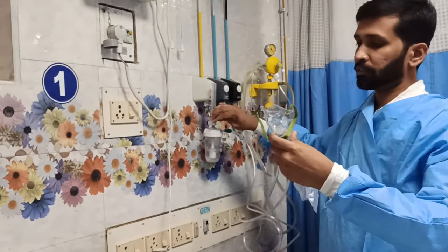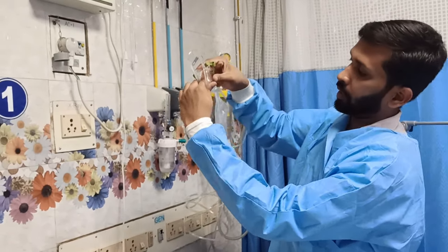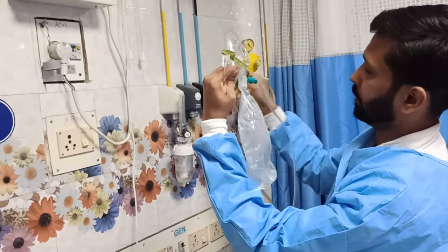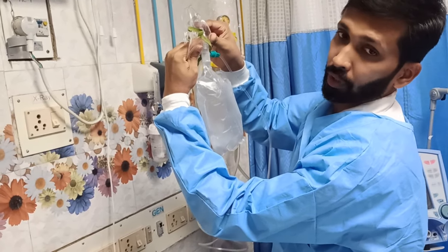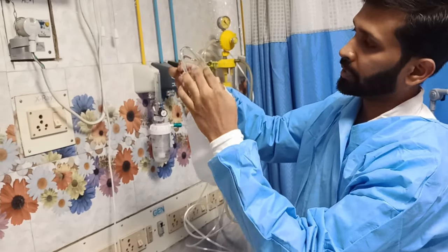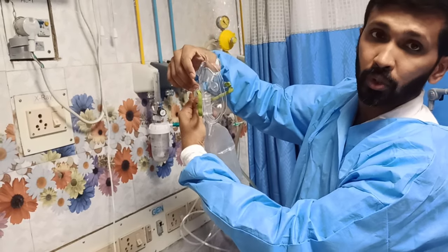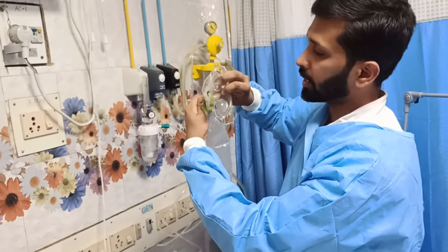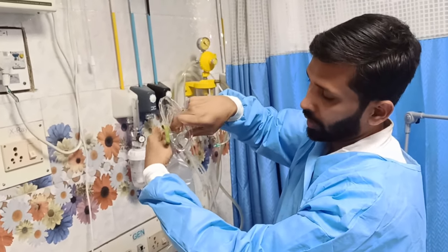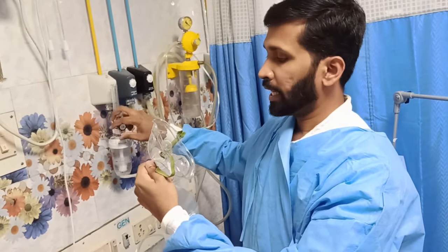Open the oxygen fully, and first close this valve, then only this bag will fill. Okay, open full and close this valve. Now it is full. Once the patient is on it, the oxygen comes from this bag, and when the patient expires, the air goes through these valves. So be careful that before starting an NRBM mask, you close this valve and fill this reservoir first.